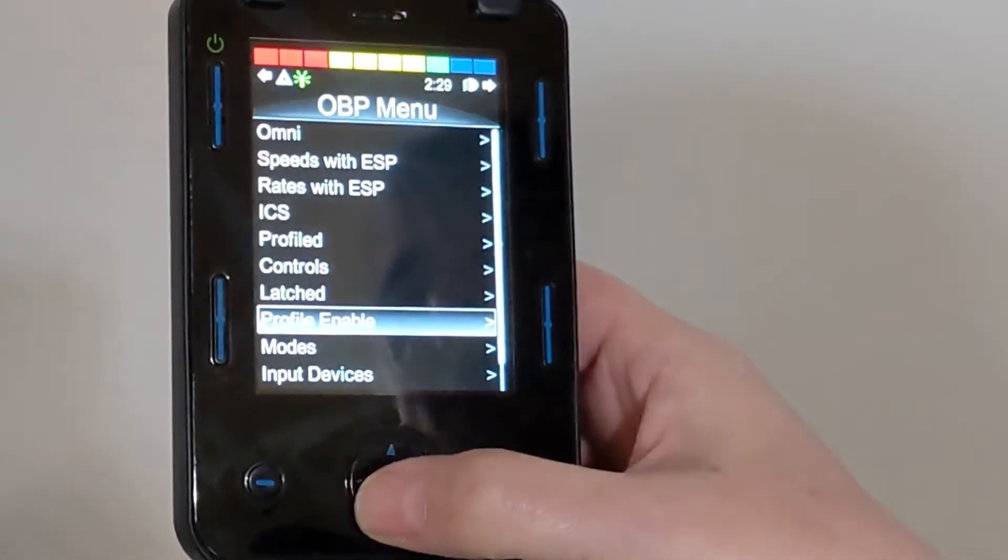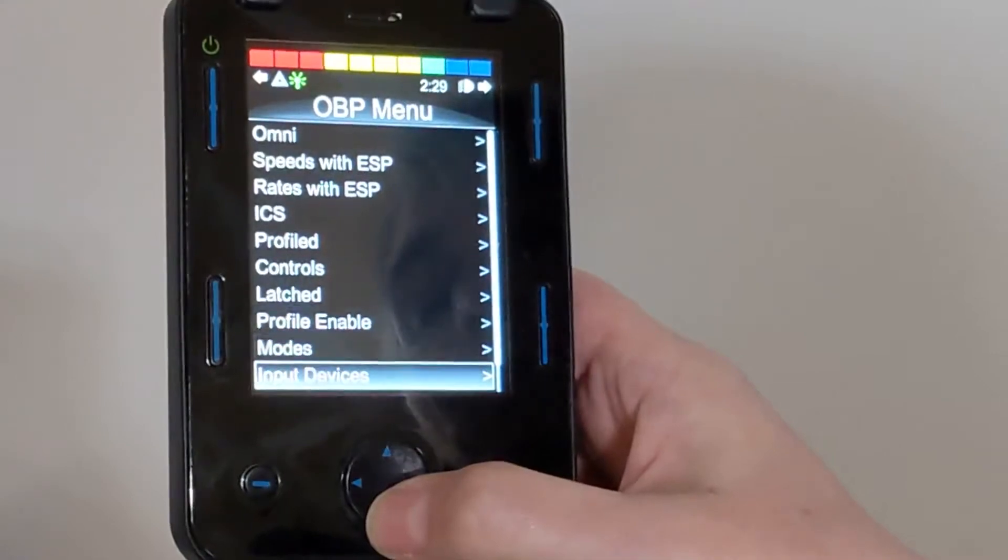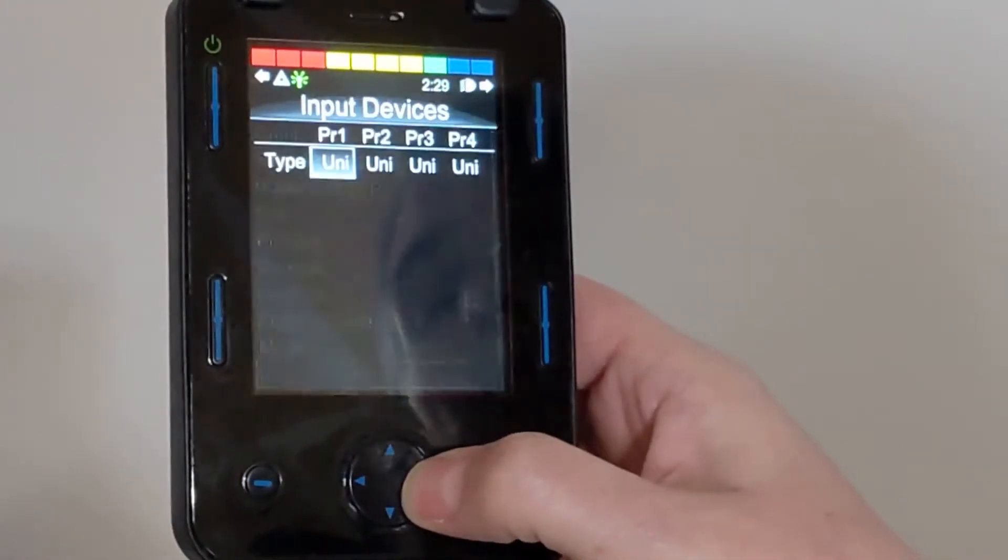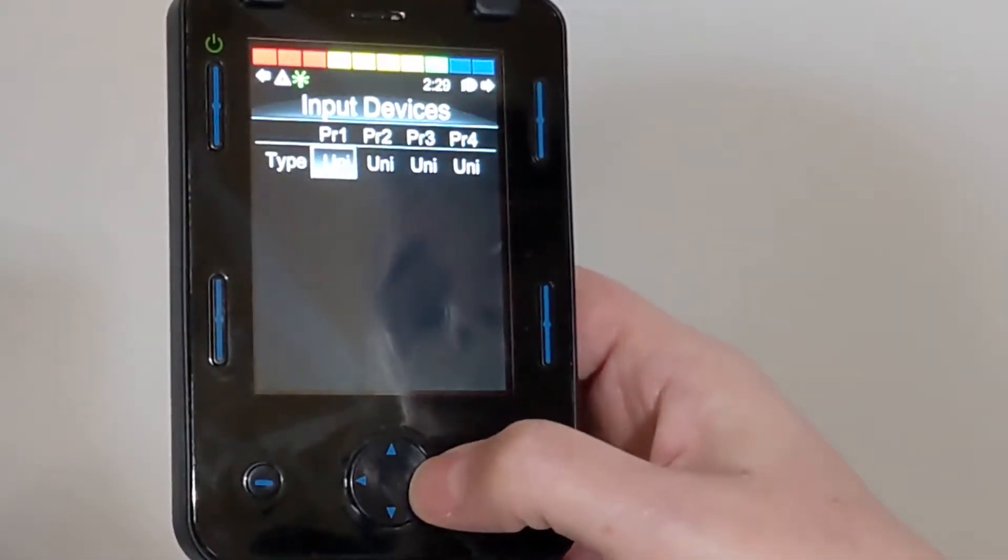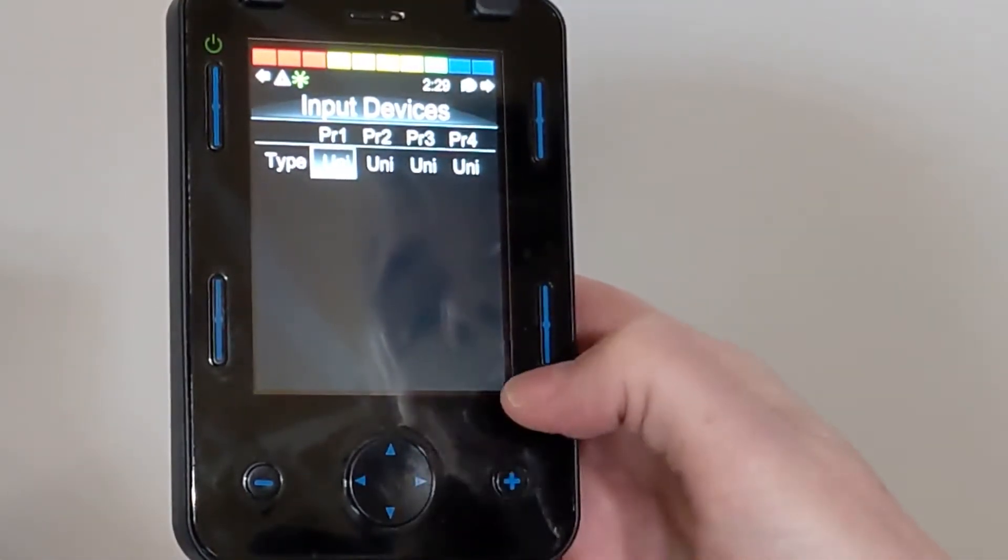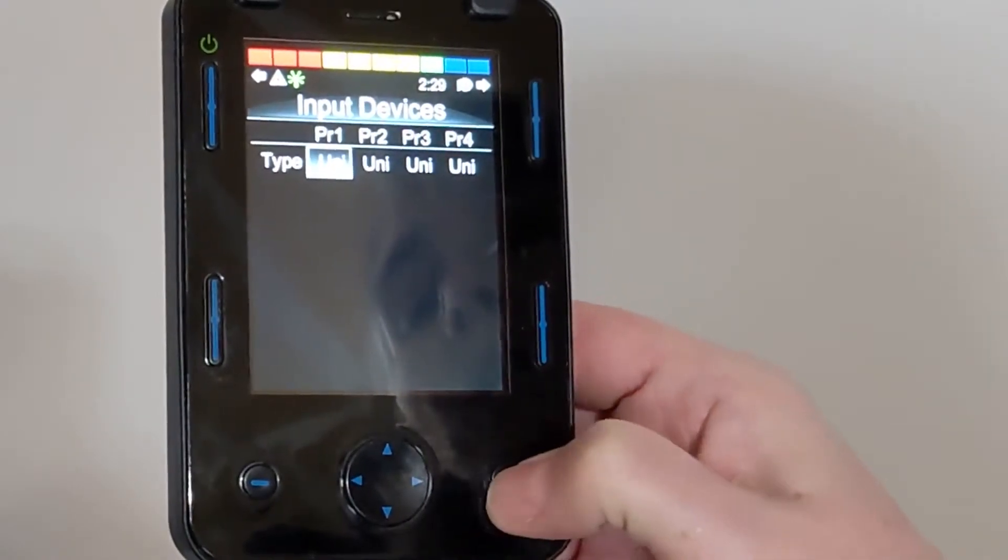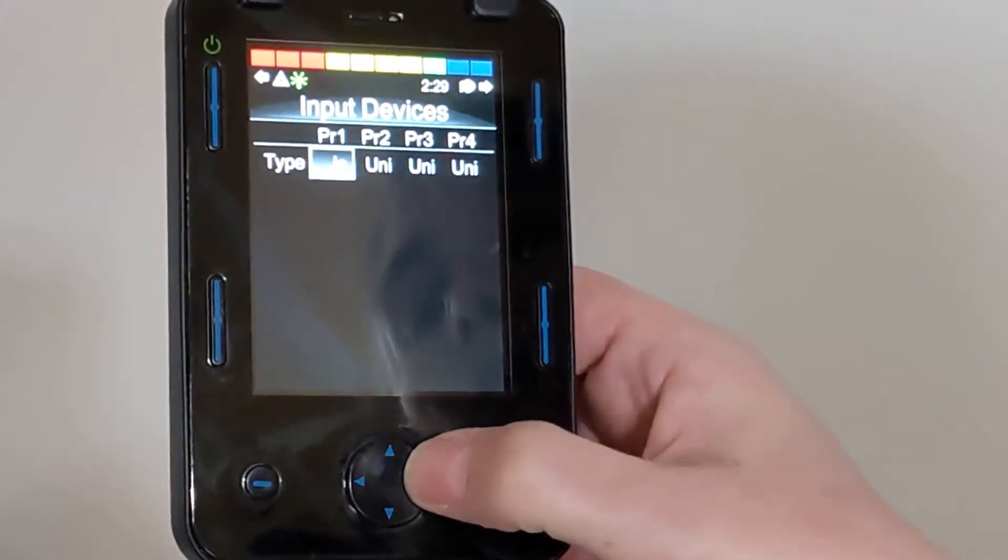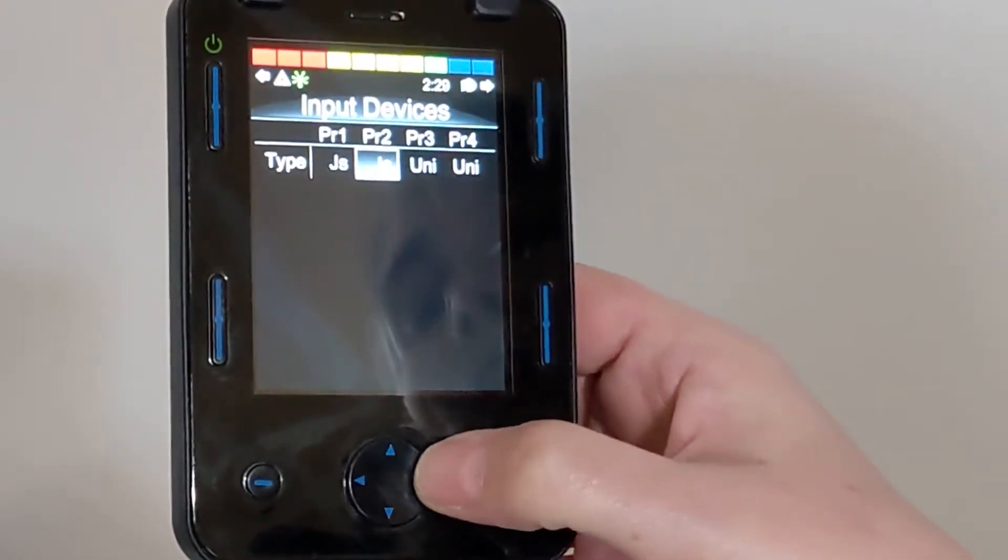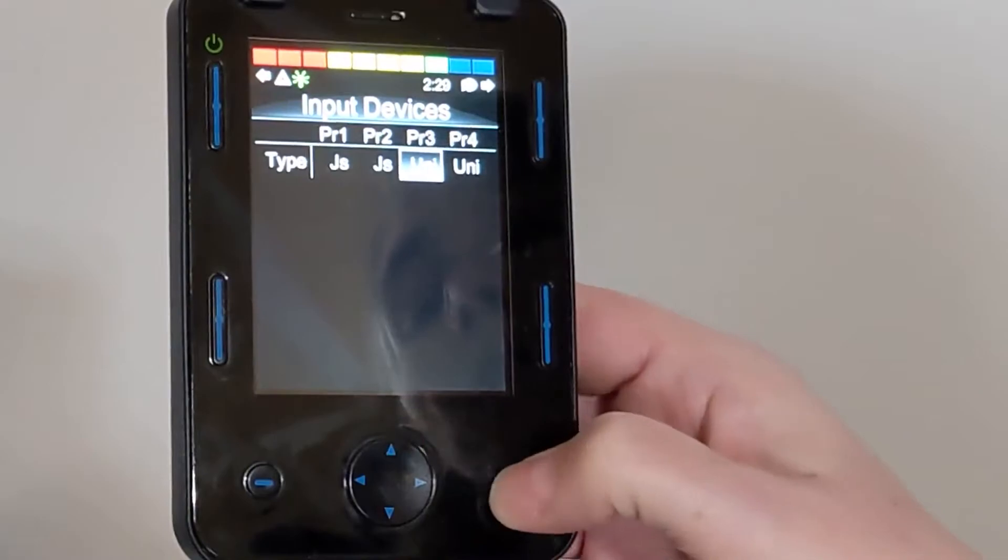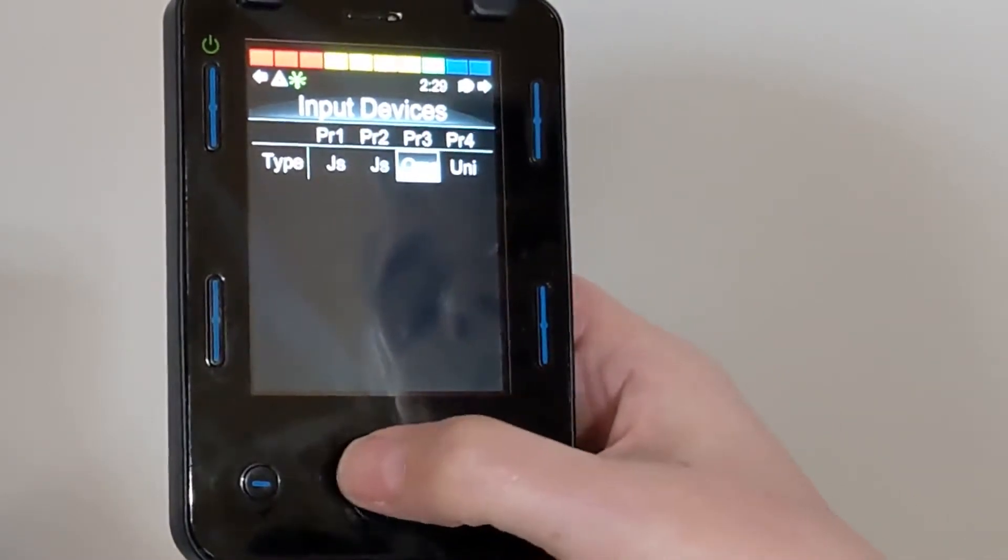Then we're going to go to Input Devices, and from Input Devices, we're going to change Profile 1 to JS, Profile 2 to JS, and Profile 3 to Omni.